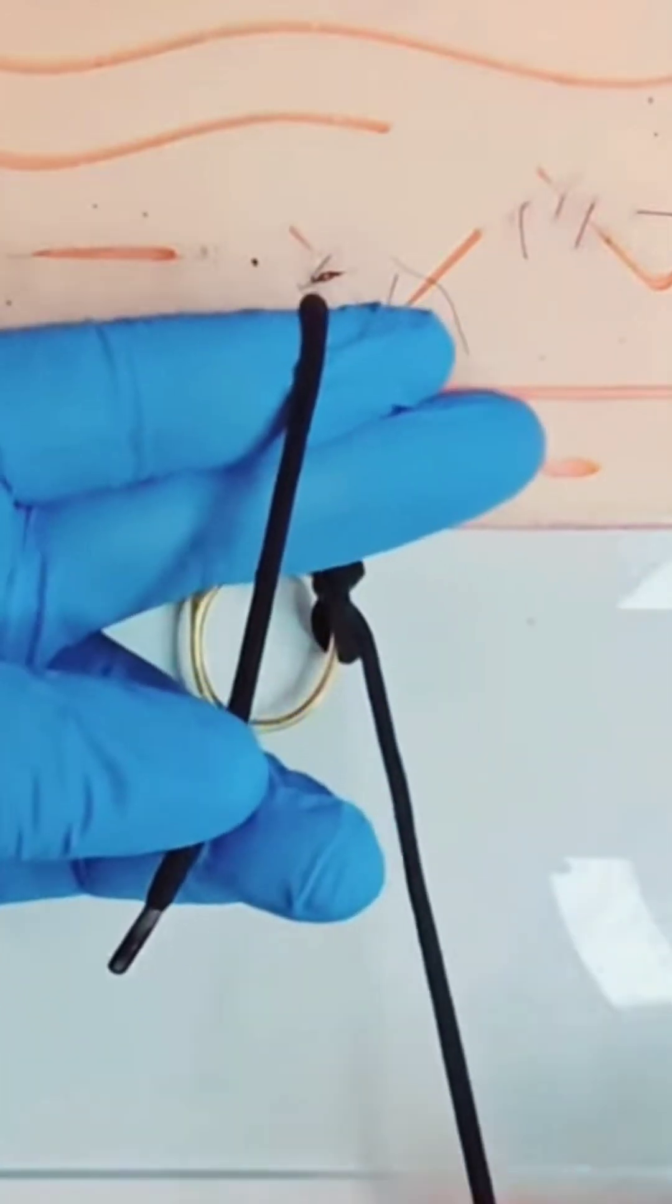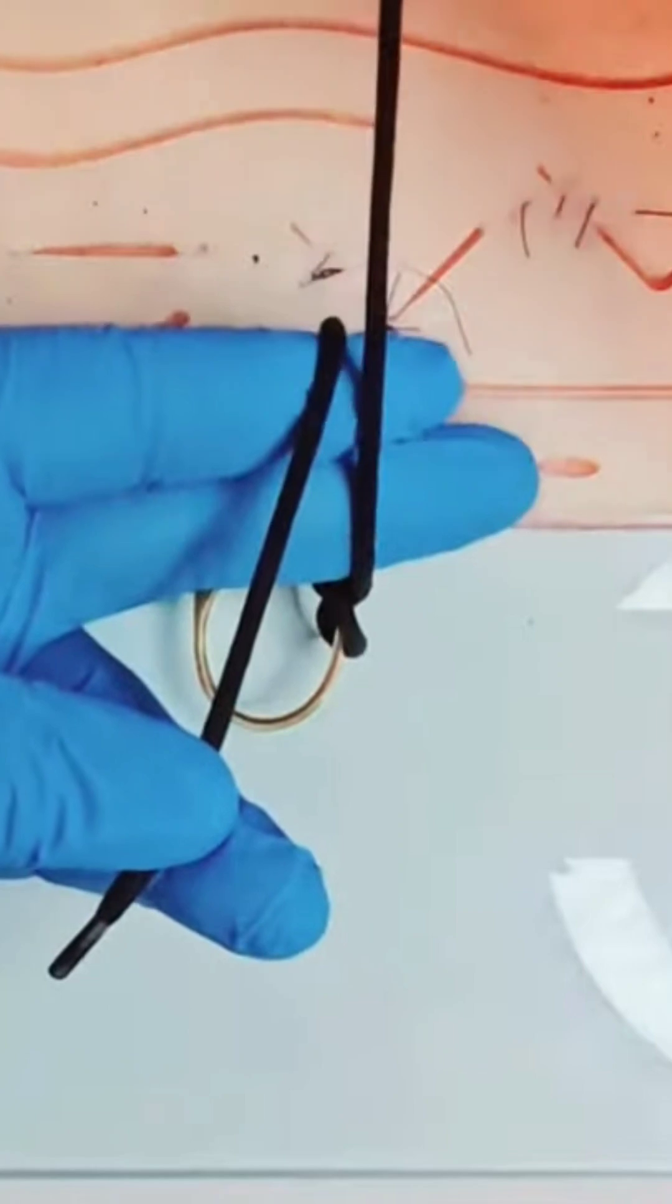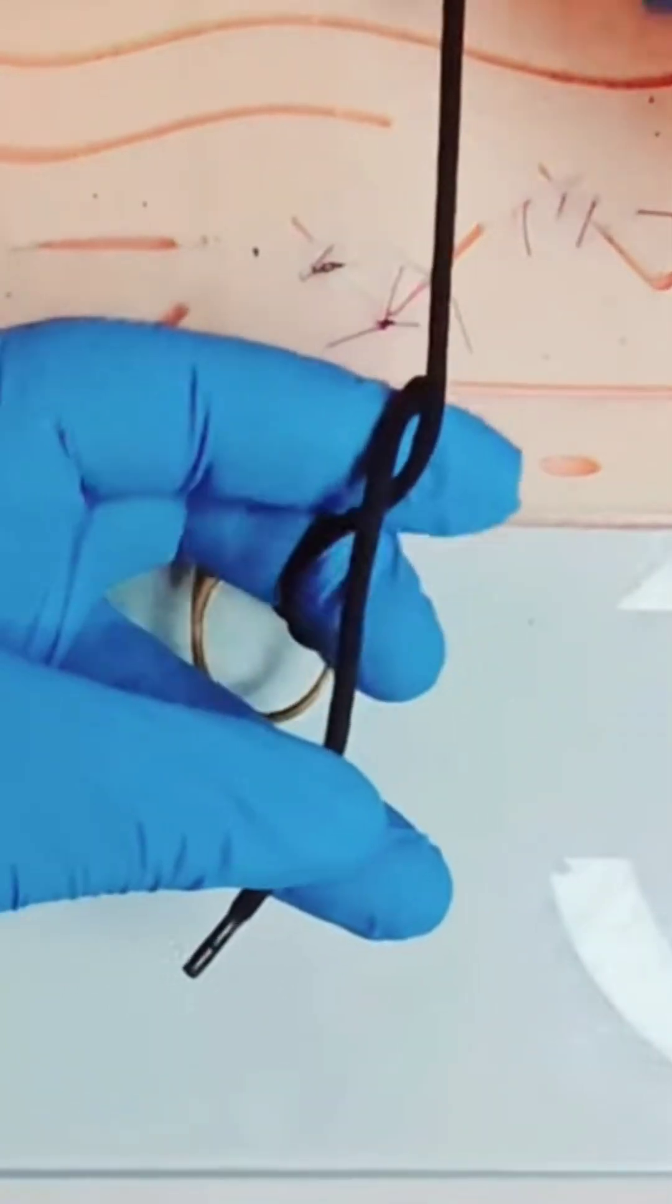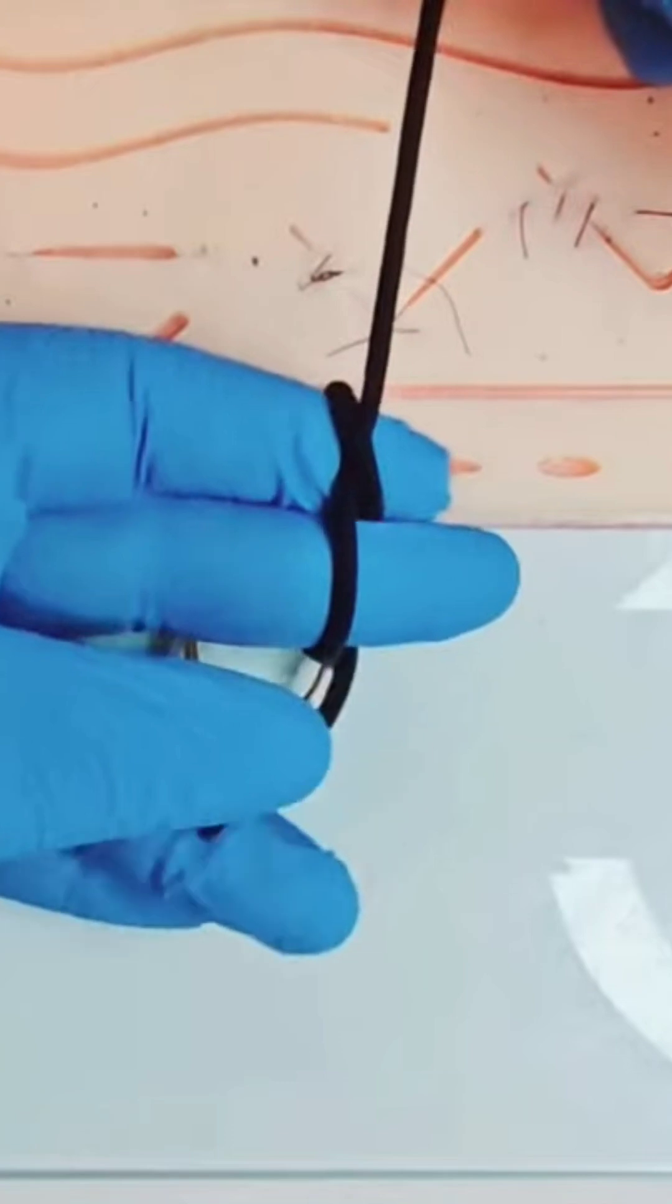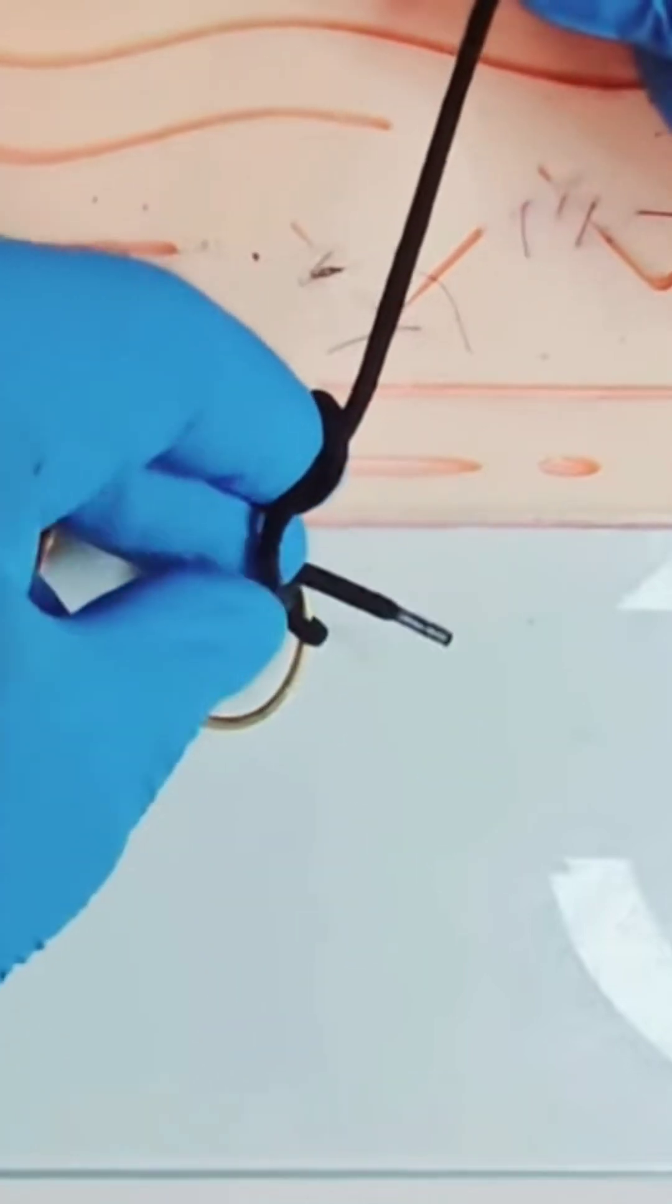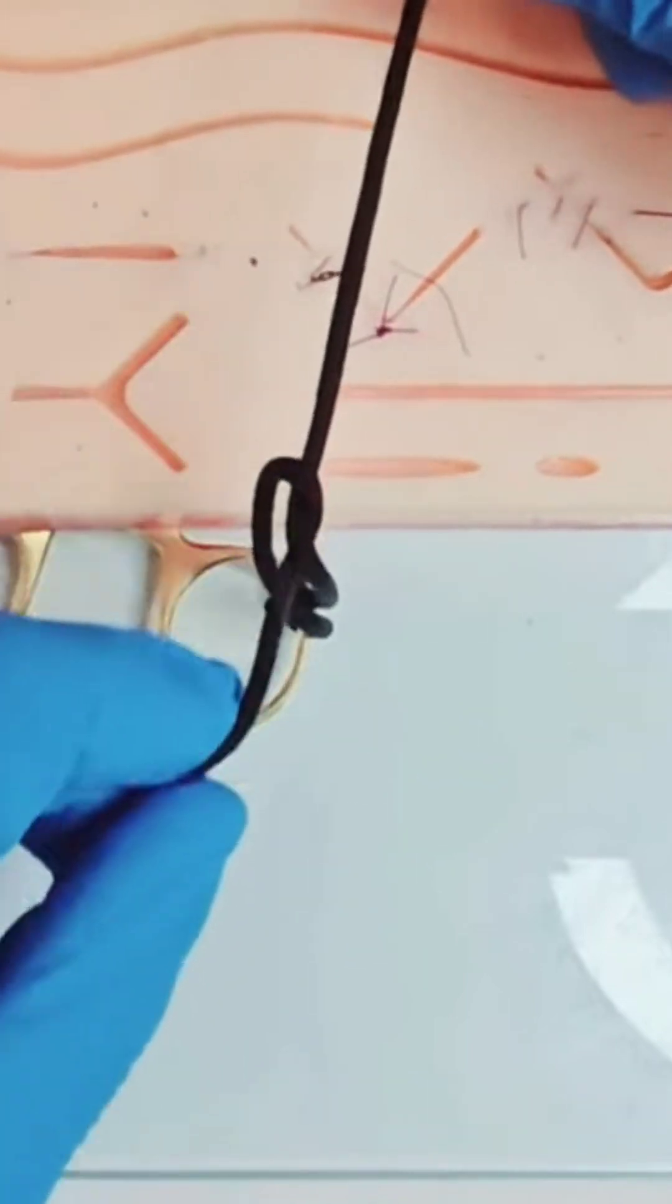Run the long suture up the index and middle fingers parallel to the short thread. Flex the middle finger over the long thread and push the short suture under it. Squeezing the short thread between index and middle, pull the short thread toward yourself.